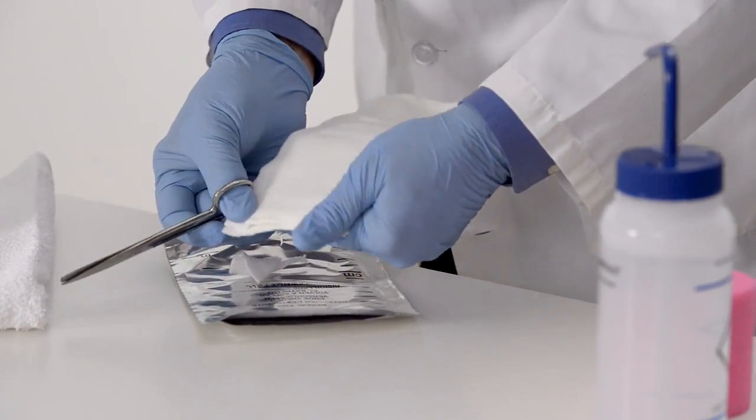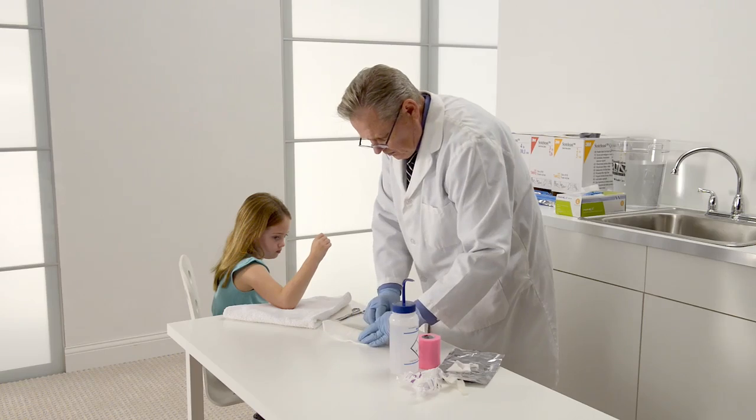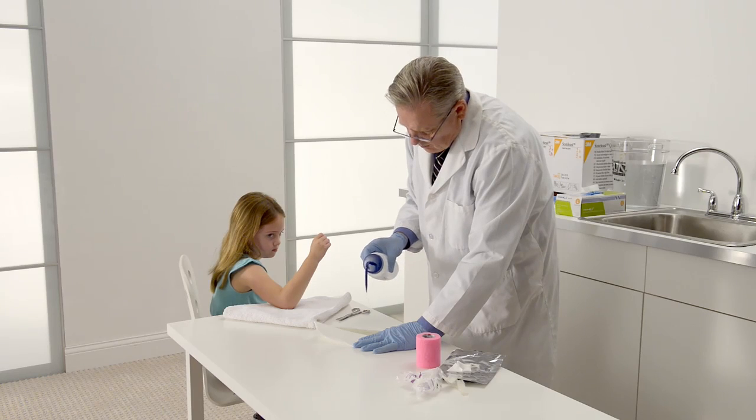Next, you need to wet the splint. You can open the felt padding at one of the splint edges. Use a water bottle to wet the interior of the splint. Replace and smooth the felt padding with your palms.